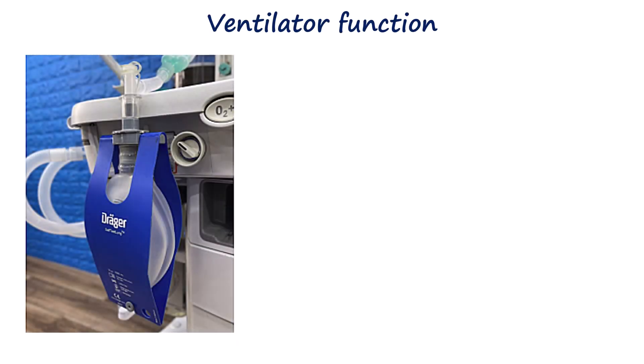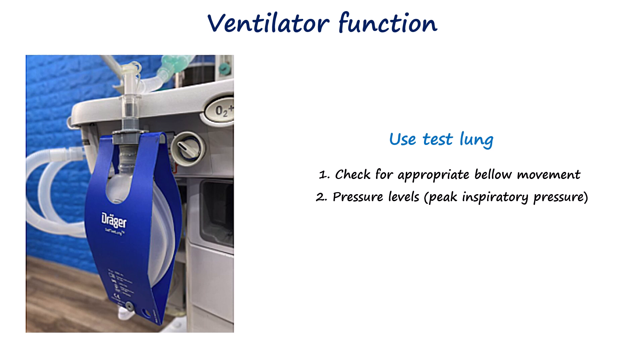The ventilator should be connected to a test lung with appropriate tidal volume and respiratory rate selected. Bellows or piston movement should be smooth, with pressures within expected ranges. Disconnecting the test lung should trigger a disconnection alarm, confirming proper function. This test should be performed routinely as part of the pre-use check, usually at the start of each anesthesia session.